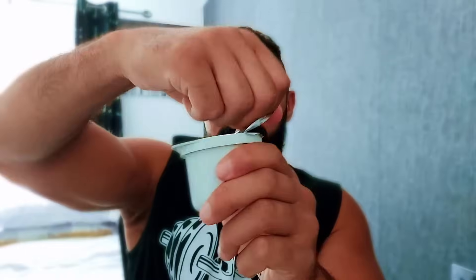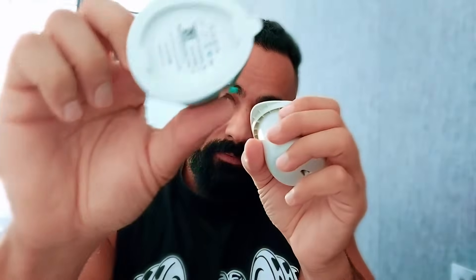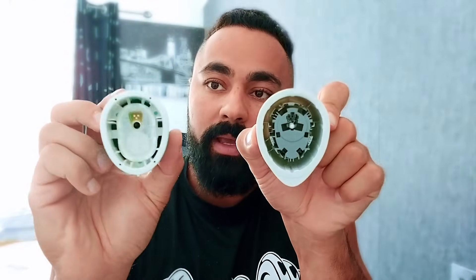So following the steps — this is the sensor. What you do is peel that cover off. This is how it looks. And then you hold the applicator and take the cover off — there's a cover here, take it off. And then you push both of them against each other.